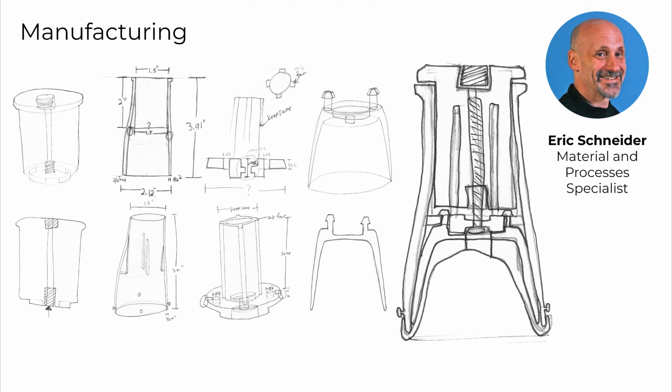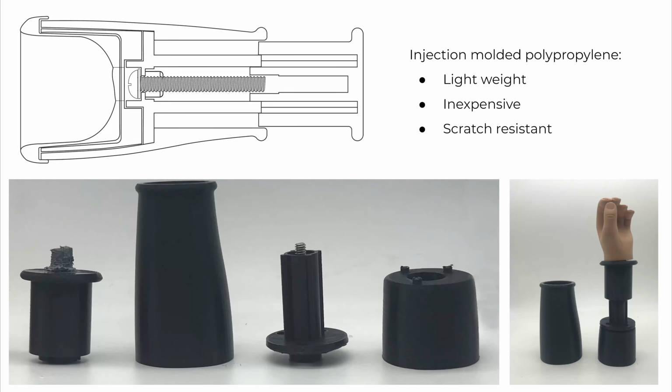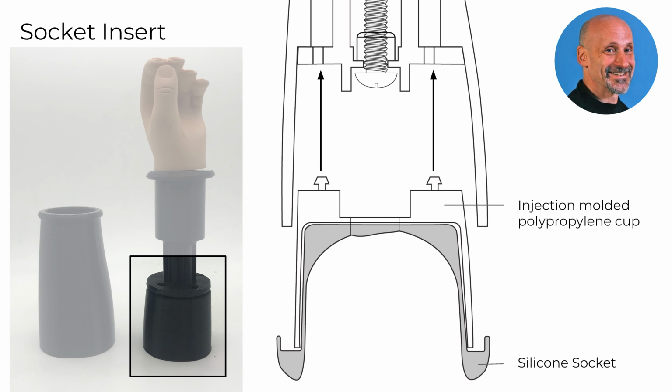Working with Eric Schneider, our material and processes specialist, we explored how this mechanism is going to be manufactured and assembled. Injection molding these components with polypropylene will allow the prosthetic to be lightweight, inexpensive, and scratch resistant. The socket is overmolded silicone casted in the cup that snaps into the forearm. This is replaced with a new insert as the child's residual limb changes form.